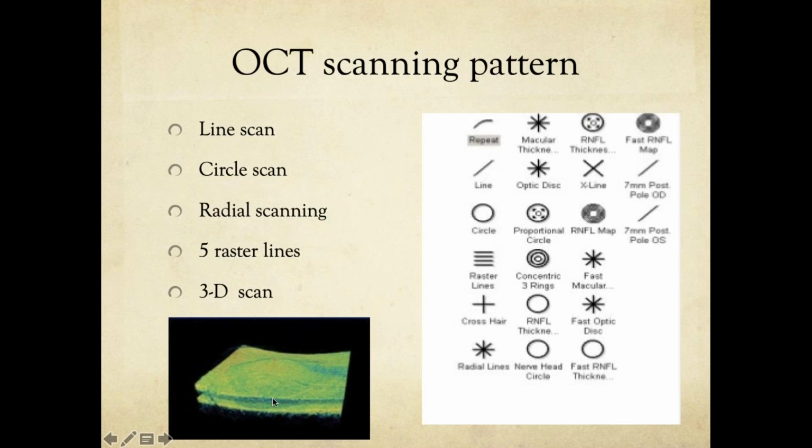Because when you're doing a 3D scan or more scans, there are multiple scans occurring at each location. For example, if there are around 512 slices of the retina that you are going to scan, and over each slice you're going to scan 10,000 or 30,000 times, then you tend to lose your resolution.